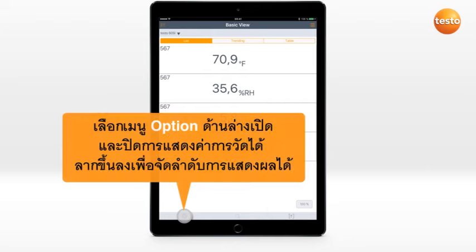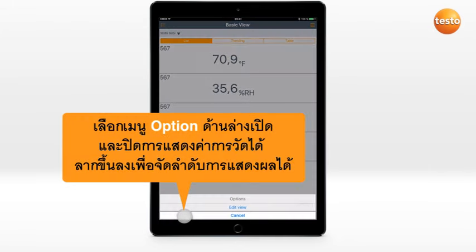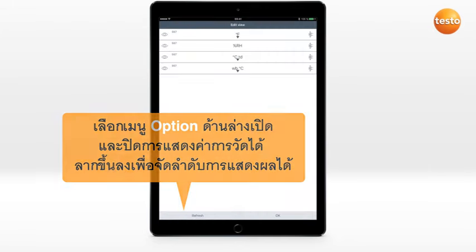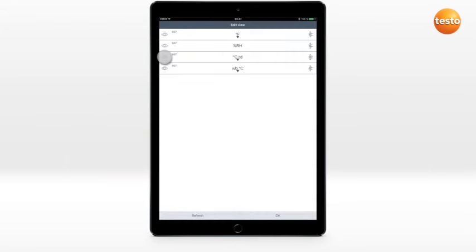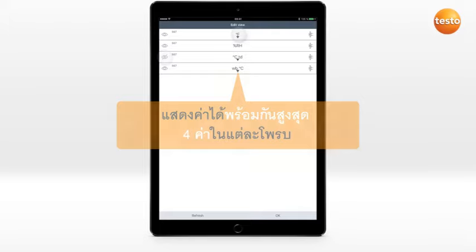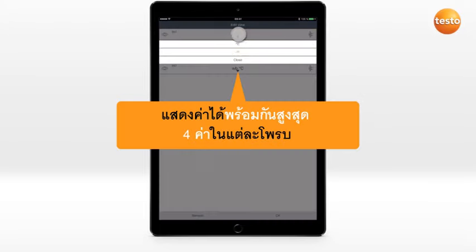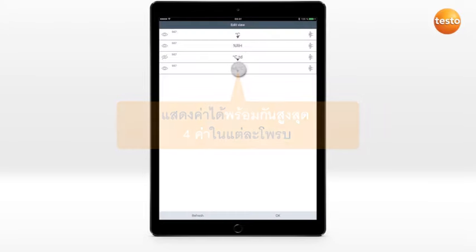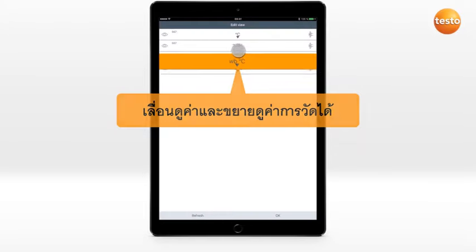To edit the measurement view, click on the Options icon. Show and hide individual parameters, change their unit, or adapt the order of presentation.